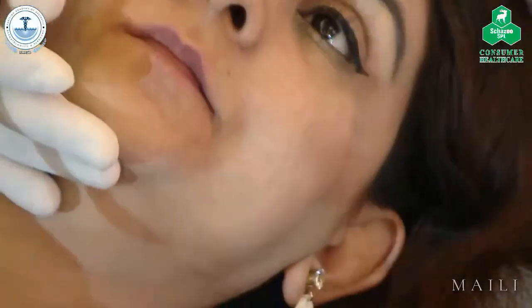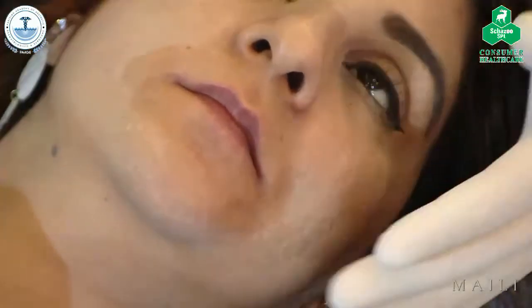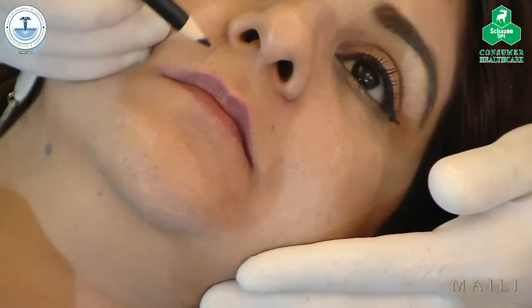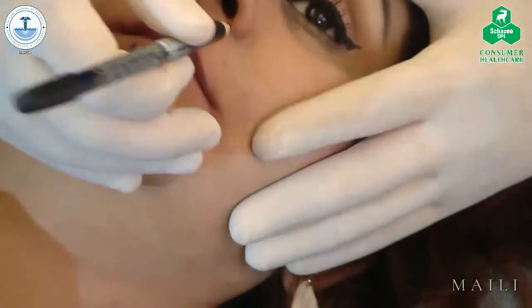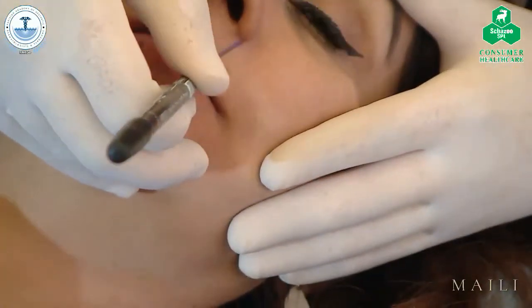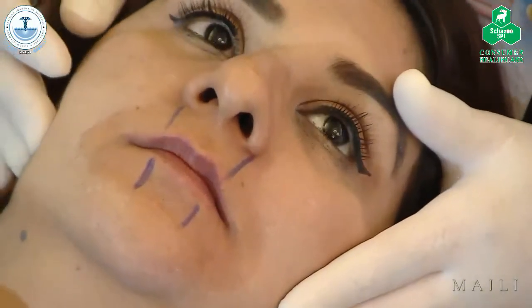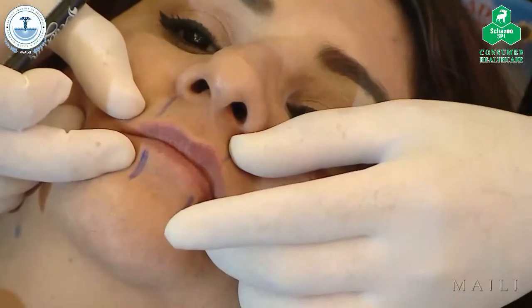Brilliant. Right. So going back to what I'm talking about, over here we're going to treat those aging lips. I'm going to start by drawing the middle third, and the middle third is the only place, the area I'm going to be working on. I'm going to avoid the lateral third.